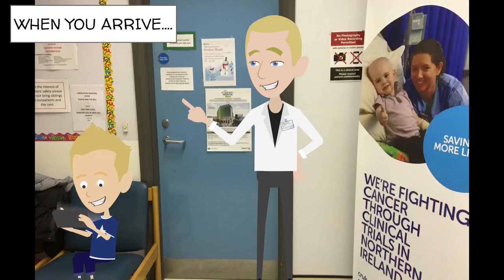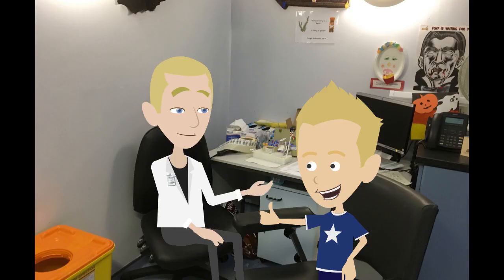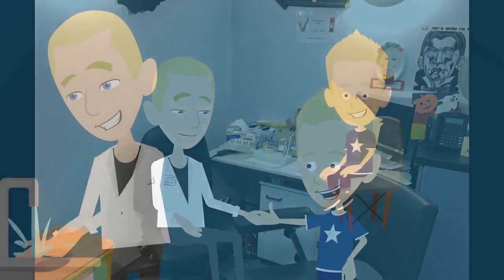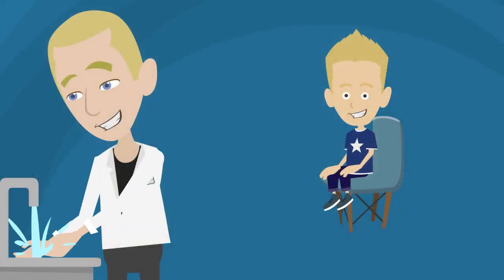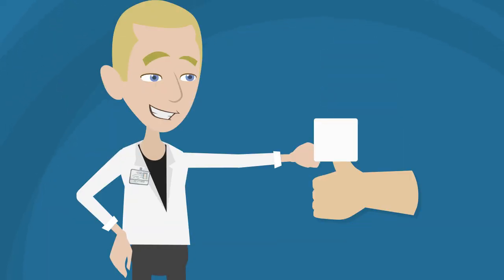When you come up to clinic, the first place you come to is our room. Here we take a few drops of blood from your thumb or finger. First you sit on the seat and I clean your thumb with a special wipe.